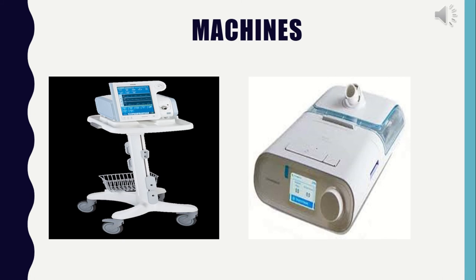Okay, so this PowerPoint is about our BiPAP. It's a bi-level positive airway pressure ventilation. These pictures right here are showing our BiPAP machines that we use. The one on the left is the BiPAP machine. The one on the right is our CPAP machine. Sometimes the patients will bring their own CPAP machines and they'll look pretty similar.